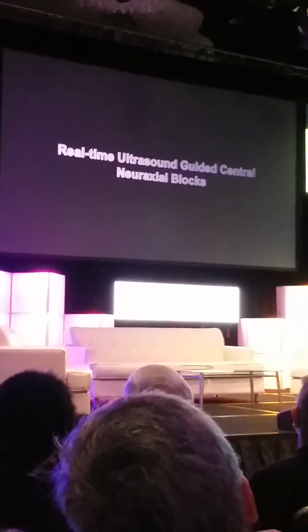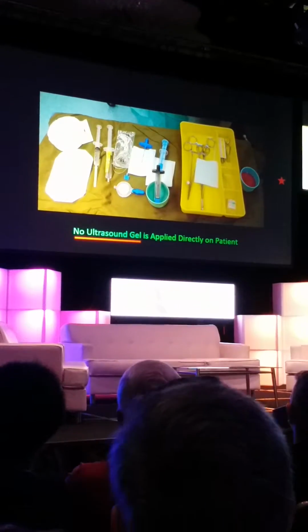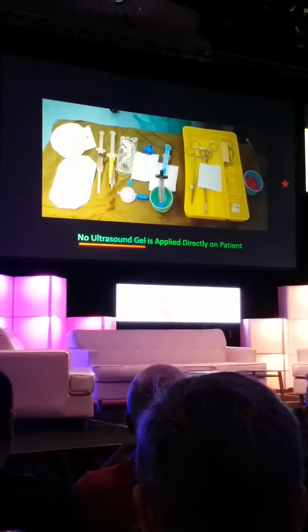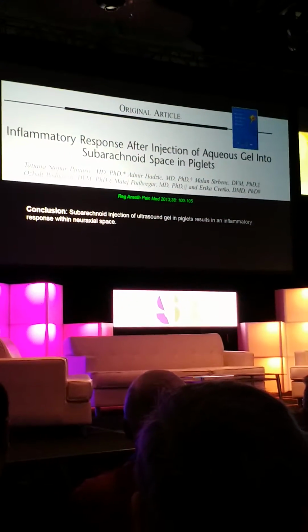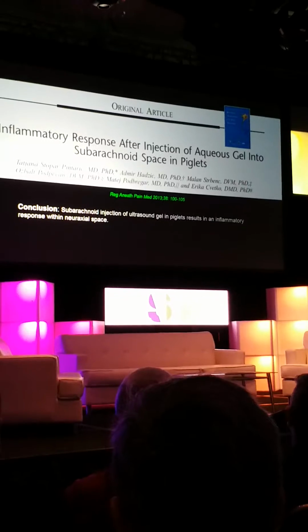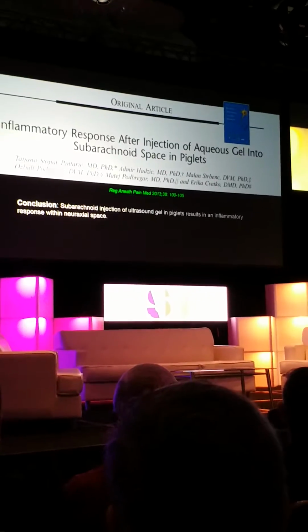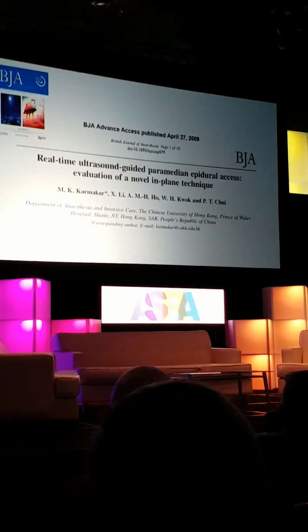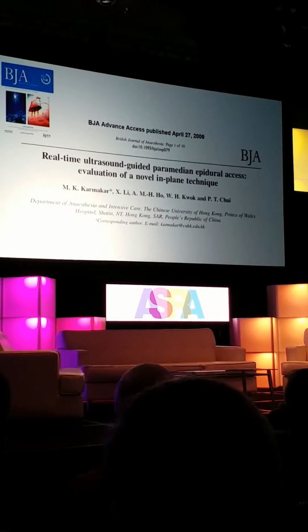And when you do near real-time interventions, the needle is introduced paramedian, but because you're doing a neuraxial intervention, no ultrasound gel should be used. Today there is some evidence that if you use ultrasound gel, you get inflammation within the neuraxis. This is an animal model study, and because there are no data in adults, we still do not use any gel in these. We tend to use saline as the alternate coupling agent, and we reported this about 8-9 years ago, where we can use real-time ultrasound to do epidurals.